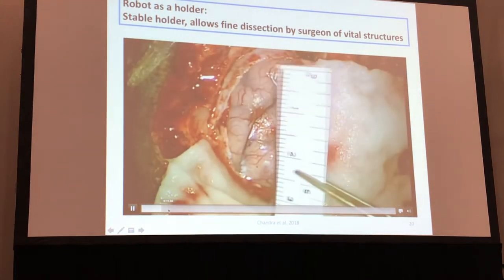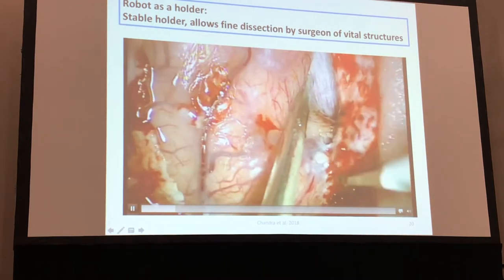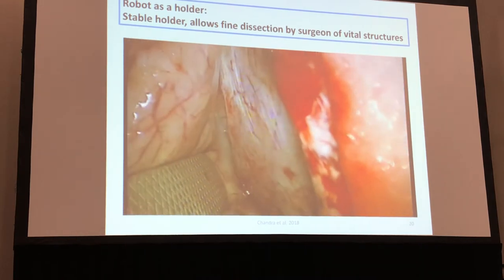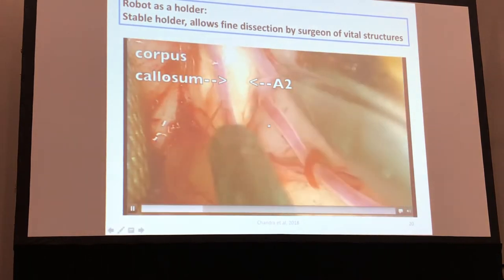So that's the size of the opening. So the whole thing is under endoscope. So you can actually magnify it or decrease the magnification. It provides a wonderful perspective. Now, the scope has gone just through the cranial opening, but we are not at the target. So we're reaching the target just by increasing the magnification.